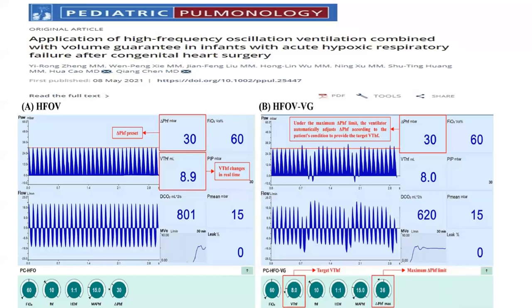And as Adib said, we usually call for ECMO to rest the lung, but maybe in some cases we could have avoided the ECMO by using this mode of ventilation, the high frequency, especially the jet form, not the oscillation, because I think the oscillation is difficult to start, difficult to maintain, and difficult to wean, to me at least. I know some people are comfortable with it, they prefer it, but if you get used to the high frequency jet ventilation, as Haytham showed, it's a better alternative than oscillation ventilation.